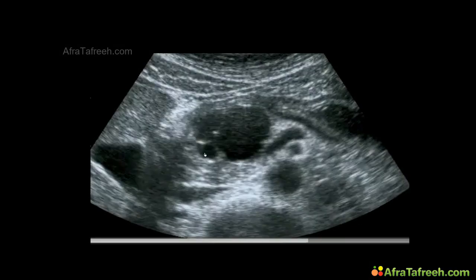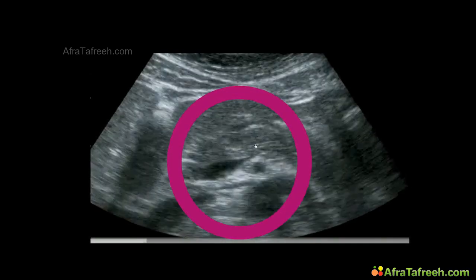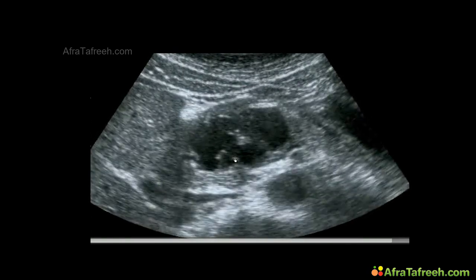So when we find a cyst in the pancreas, you describe the localization, whether there are septa and nodules, but overall it's not so easy to make a diagnosis using only a sonographic examination. In this case, we see cystic lesions with multiple septa in the head of the pancreas. It depends on the age of the patient and the gender which diagnosis is more likely.